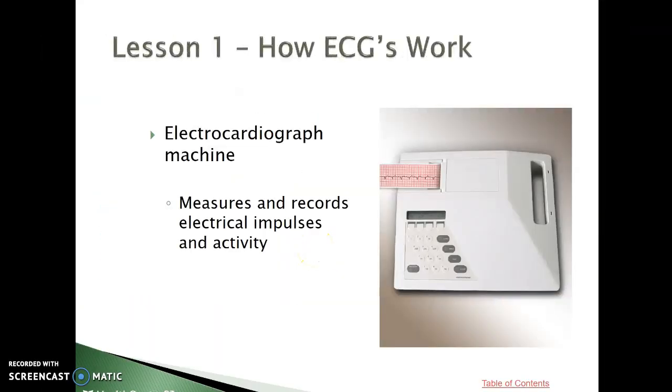Okay. I'm going to go through this really fast, so at any time just pause it, rewind it, whatever you have to do. But basically, an EKG is nothing but a machine. They look various, depending on which company makes them. I have 3 different examples in the lab, which you'll all get to use. But basically, it measures and records the electrical impulses within the heart.